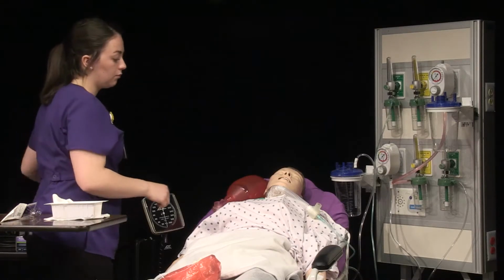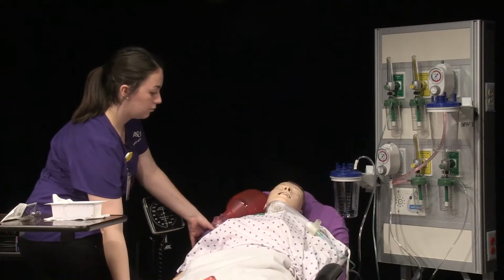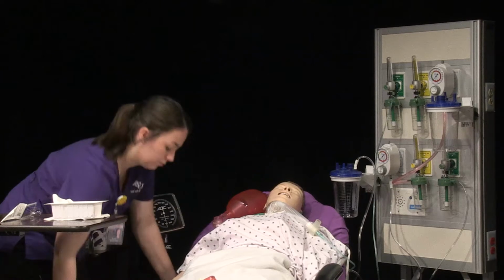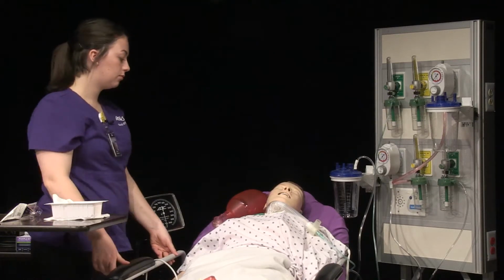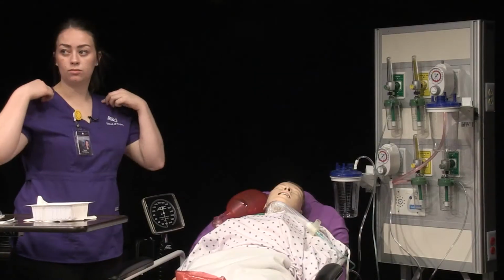Okay. Return the bed to its lowest position. Raise the side rails. And verify that the call light is within reach. Don clean gloves.